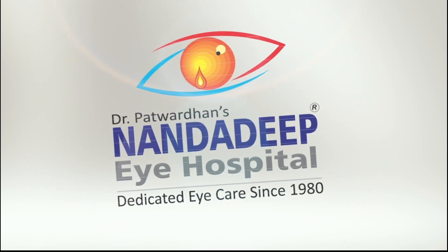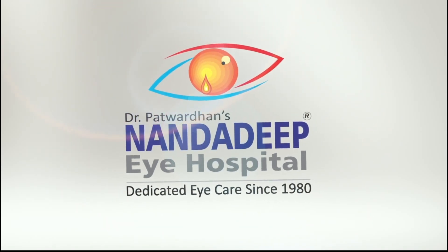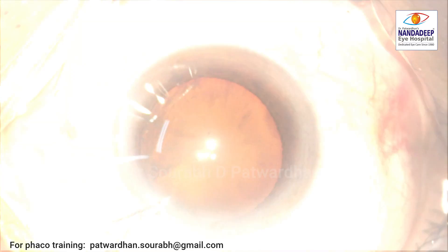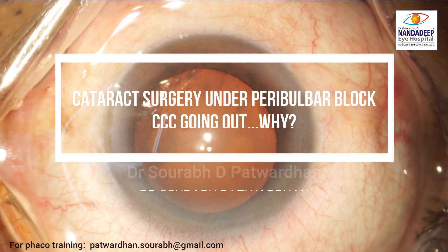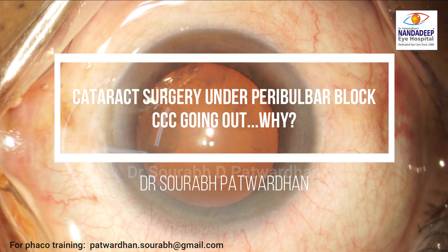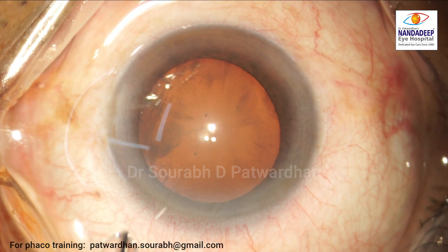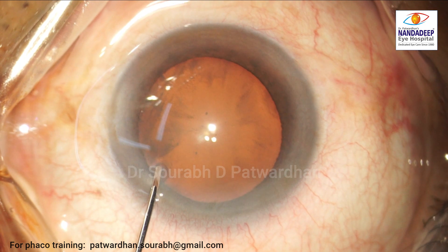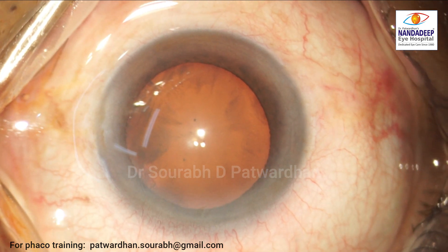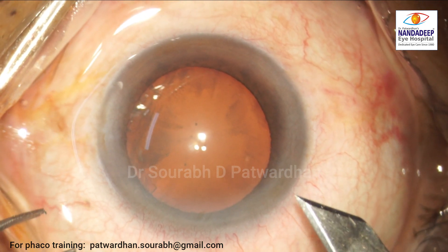Hello, this is Dr. Saurabh Patvadhan from Nanda Deep Eye Hospital. In this video, I will be speaking about a case which I did under peribulbar block because I was planning to do a combined phaco with vitrectomy and the CCC started going out. So let's have a look.